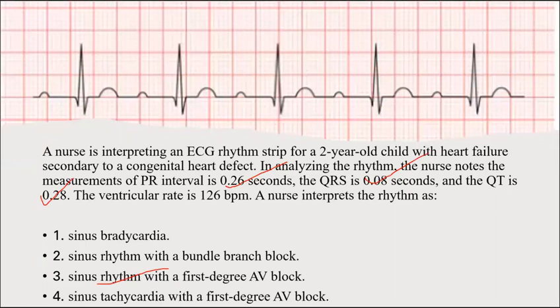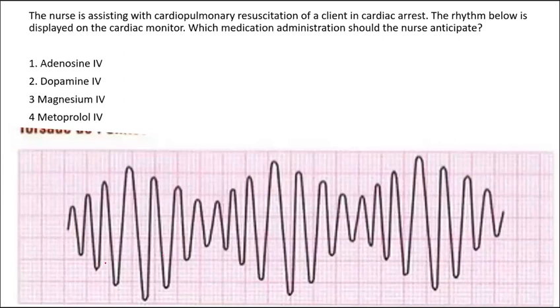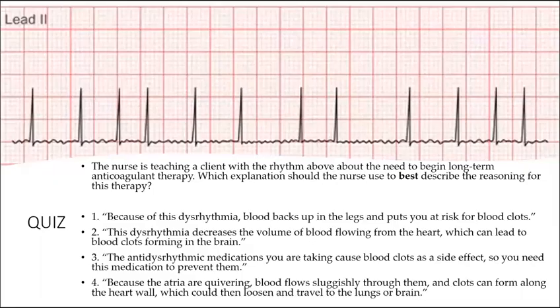Again, not just cramming the pictures of 8 popular ECG rhythms you need to know. The exam is not a content exam. You can go ahead and cram all you want to cram, but if you don't understand the basics behind all of this, then you're going to find it difficult on the Nclex. Once I see this, I remember my magnesium. So again, I can write my M here, and that reminds me of my magnesium. I know I have to give magnesium to this client.